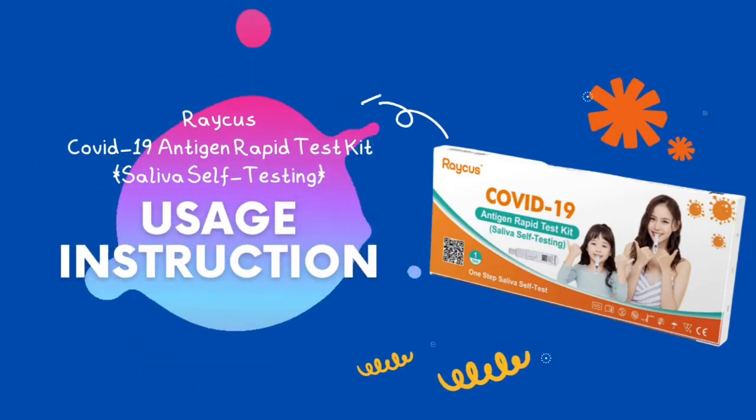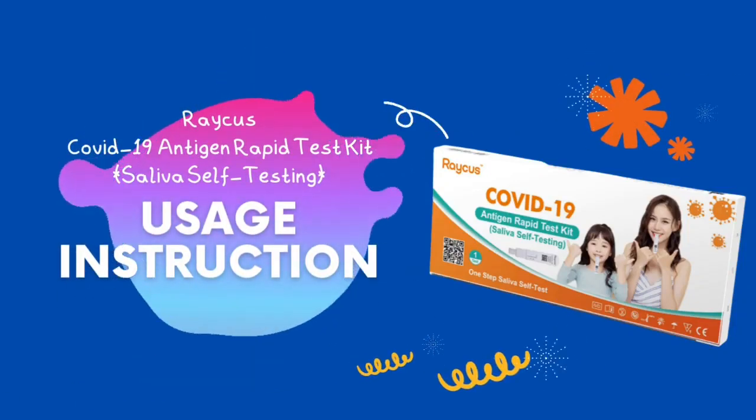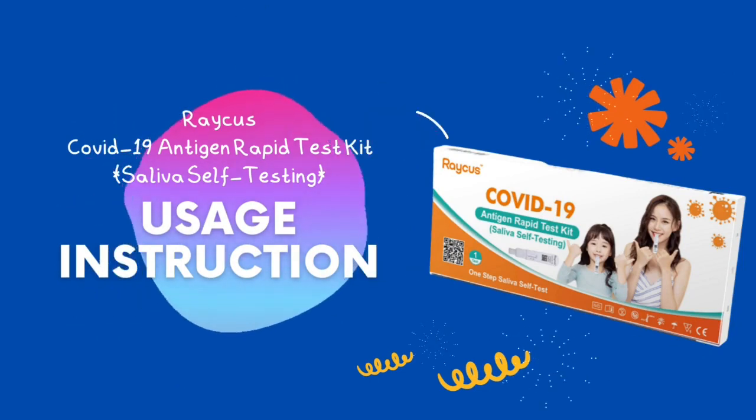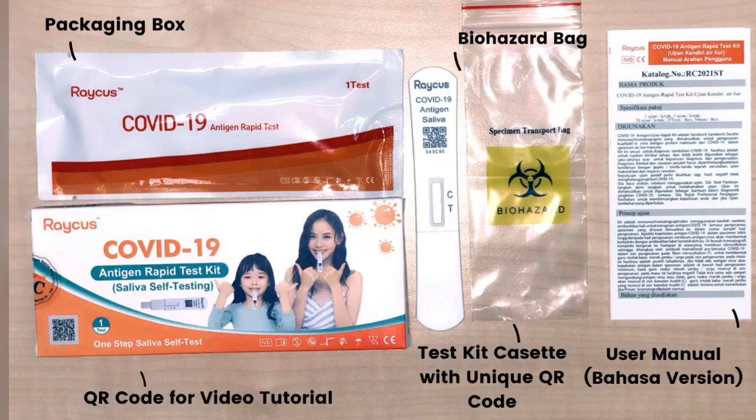RAKERS COVID-19 Antigen Rapid Test Kit Saliva Self-Testing Usage Instruction. This product contains a packaging box, QR code, biohazard bag, test kit cassette with unique QR code, and user manual in Bahasa version.